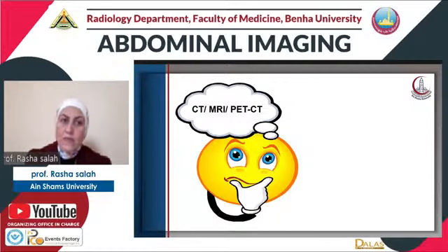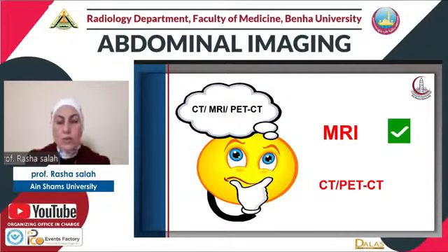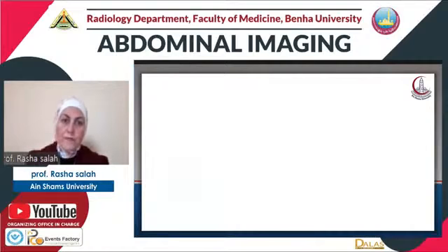So, can we ask for CT or MRI or PET-CT for evaluation of rectal cancer? MRI is the best choice for local staging of rectal tumors, but CT and PET-CT are reserved for staging of the abdomen and distant staging, including the chest, if there is any clinical suspicion of distant metastatic lesions.